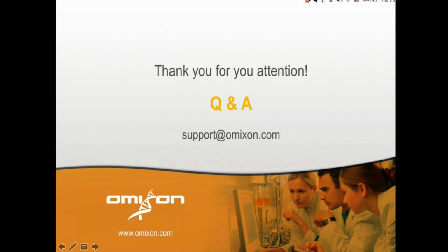All right, thank you, Libor. Another one that I see here is, when will holotype HLA v3 be available? And I can answer that actually really quickly. Holotype HLA v3 is under external testing right now, and it will be publicly available within the next couple of months. By the end of October, it should be expected.